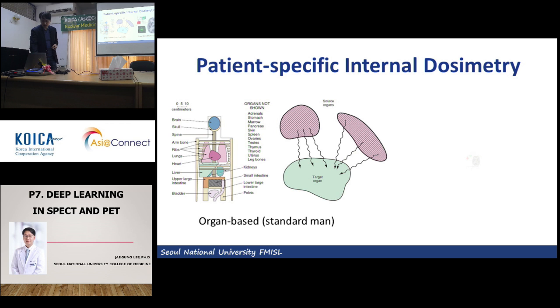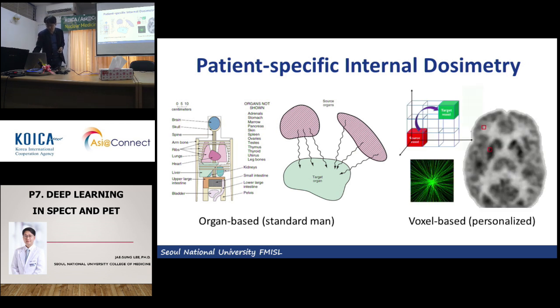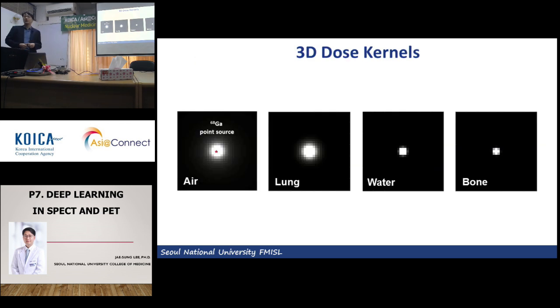I think there is enough rationale, because as Professor Hong Yun Choi told yesterday, we use a convolutional neural network, and those calculations are also based on convolution.